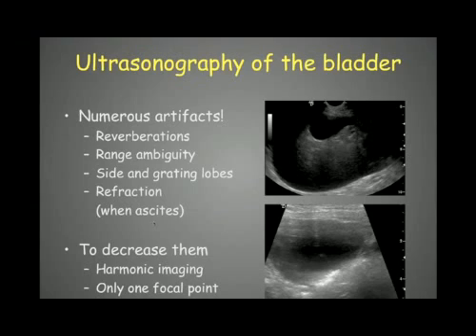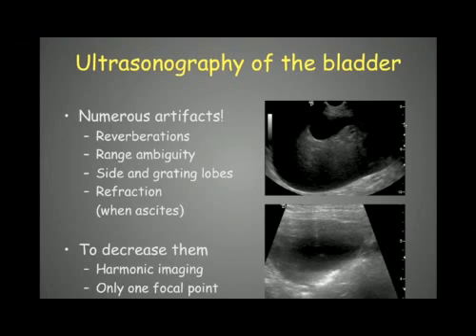To decrease artifacts, we should use only one focal point — here we have four, which is definitely too many, so we should use just one. We should also use harmonic imaging to decrease the side and grating lobes.